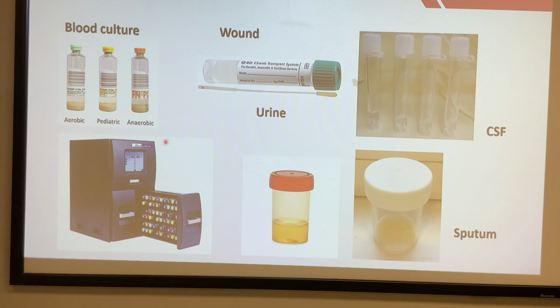CSF, do you know what CSF is? Cerebrospinal fluid. Aw, so nice. Okay, I'm impressed. So CSF is another very commonly seen sample in our lab. I do want to mention this little cute guy in the corner, that is the blood culture machine. What it does is detect any color change caused by growth in the blood culture. Even though there might be growth, it could be just common flora on your skin from when they do the stick, or it could be something irrelevant. But anyway, this is very cute, and I do want to show you that.